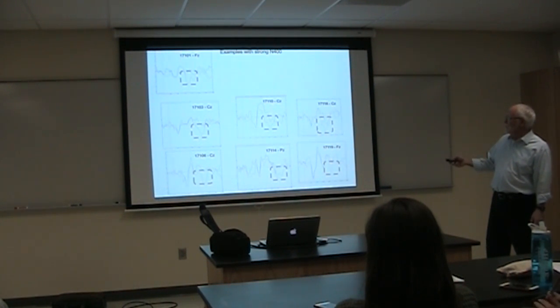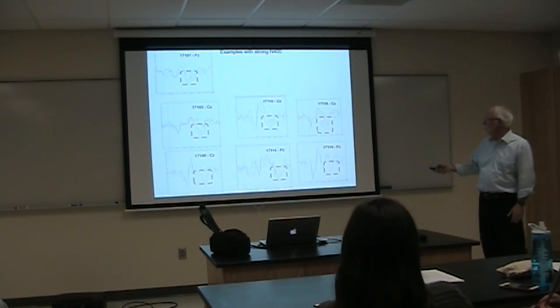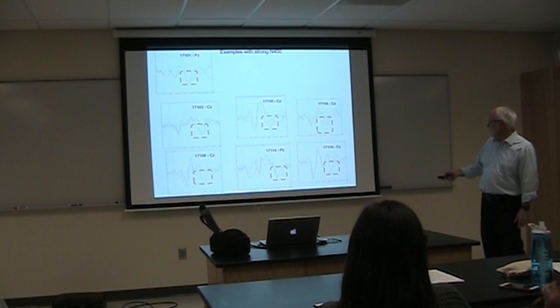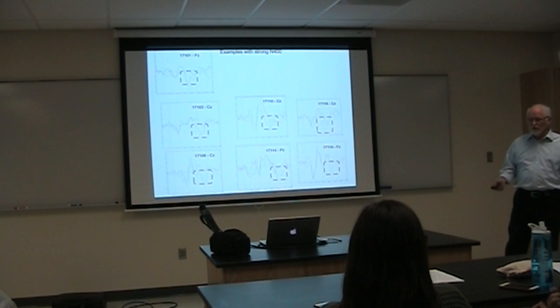This person, 110, showed a little bit of an N400 even on the normal sentences, which is not that unusual, but the difference between the normal and the nonsense is pretty clear. And here we have another example. That's a really good example of the N400. Here we have N400 with normal and nonsense, but the nonsense one is much stronger.